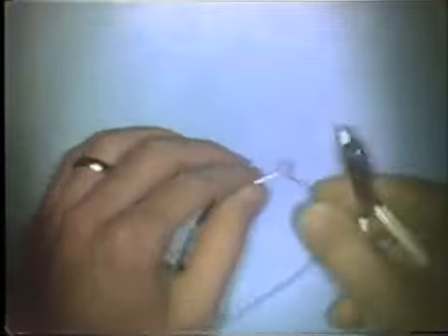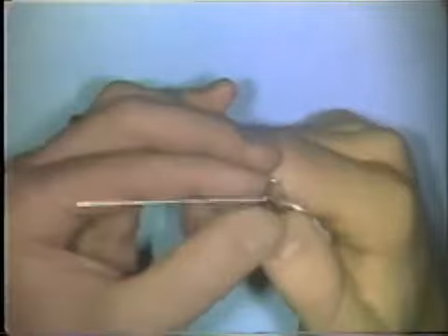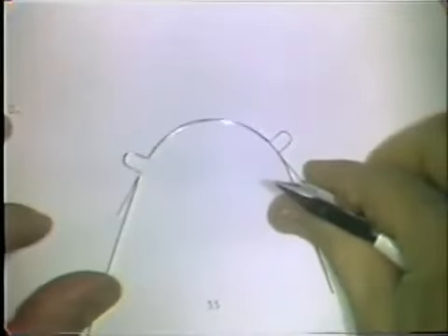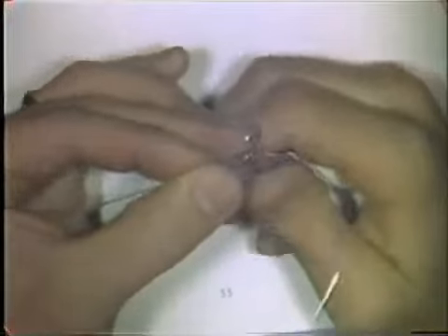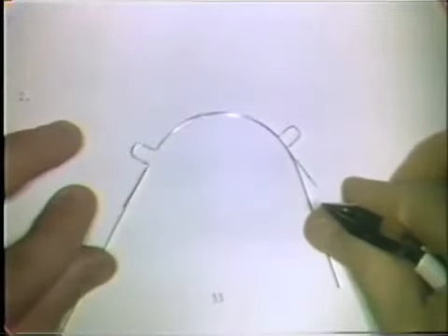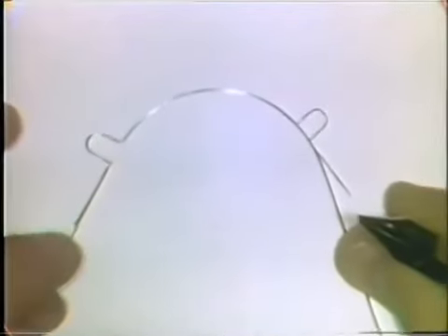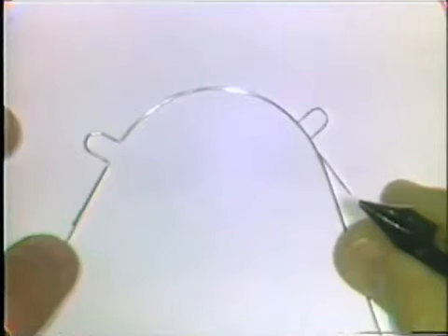Now, you complete the formation of the 90-degree bend and try it back on the pattern. A little more bend is needed. And the first half of this curvature exercise has been formed. The wire should lie directly over the lines on the pattern and should be flat on the table surface, and the wire should be free of nicks, scratches, surface defects.